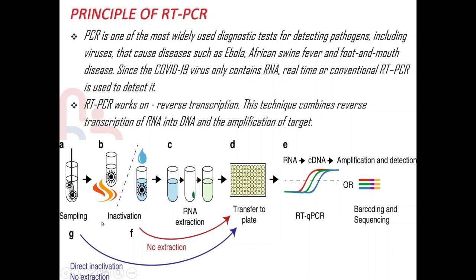Unlike the widely used approach, which includes an RNA extraction step using industrial RNA extraction kits, this detection sample testing circumvents this process by omitting extraction. Instead, after clinical samples are deposited in transport medium, viral particles are inactivated either through heating or by direct lysis in detergent containing buffer. The inactivated samples are then used for the downstream RT-PCR diagnostic reaction.